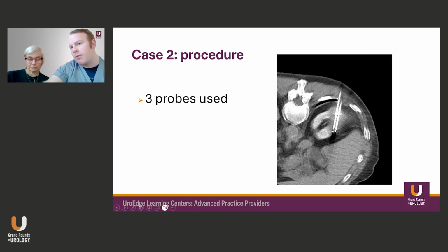So I definitely want to avoid going through the lung because the risk of pneumothorax would be quite high with these probes. But you can see the ice form around the cryoablation probes, and then there's some fat stranding, a little bit of artifact from the metallic instruments here. So the larger the tumor, the more probes you use, correct? Yep. Makes sense.